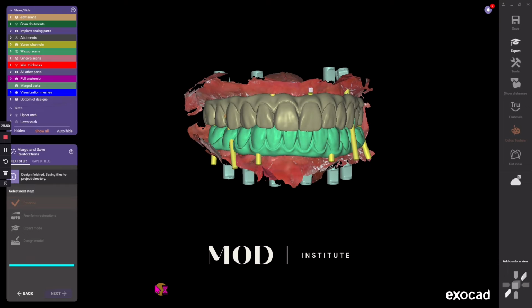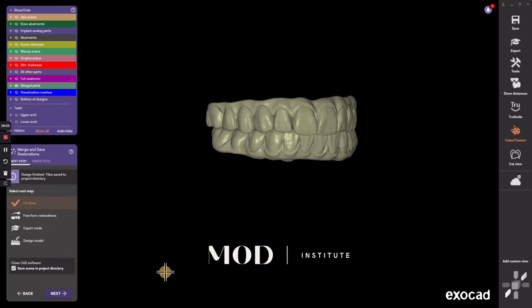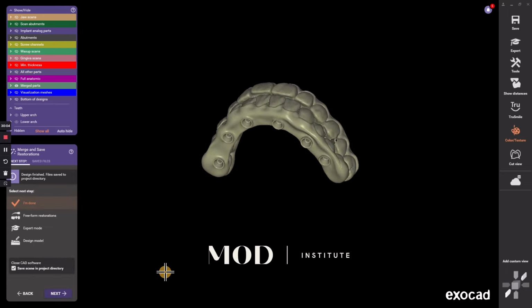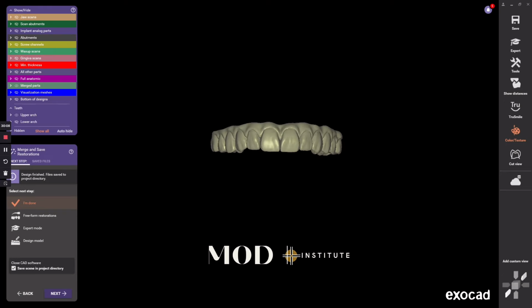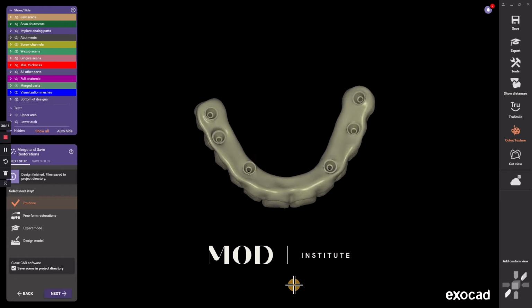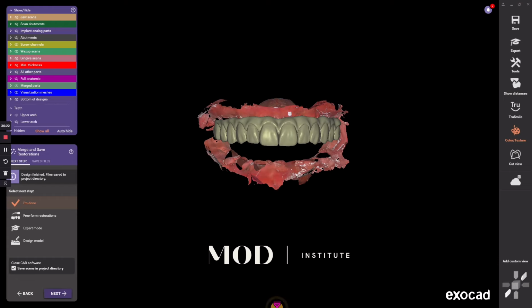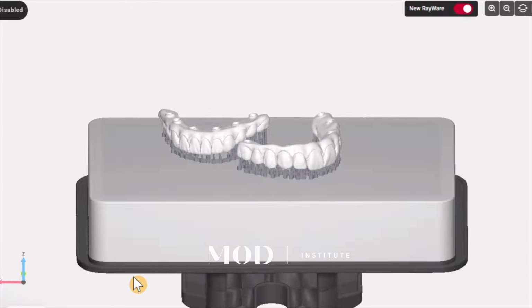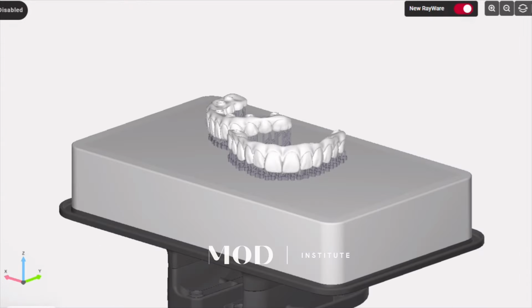And so here's the final merge part, which is in this kind of Ninja Turtle green. And if I rotate and look, now we have the direct to MUA caps cut in, and we have perfect little screw channels. Let's zoom in here. See, perfect little screw channels for their direct to MUA screw. And then this could be 3D printed as a trial prototype or milled in zirconia. Here we're 3D printing it for a nicer prototype here.